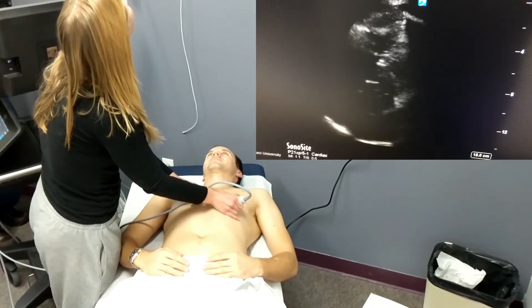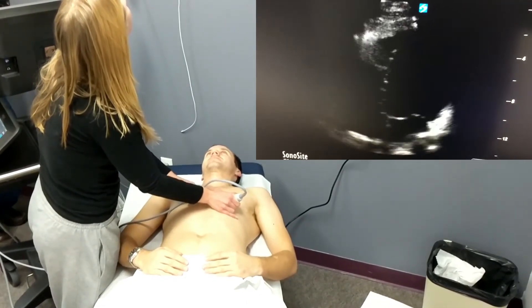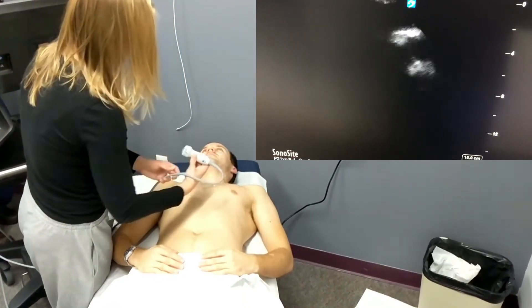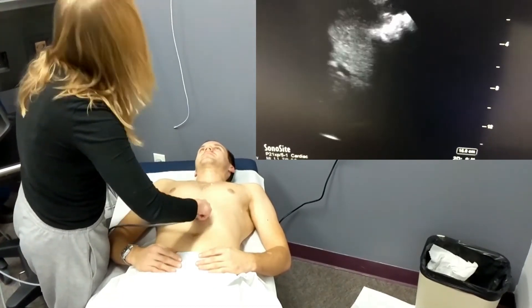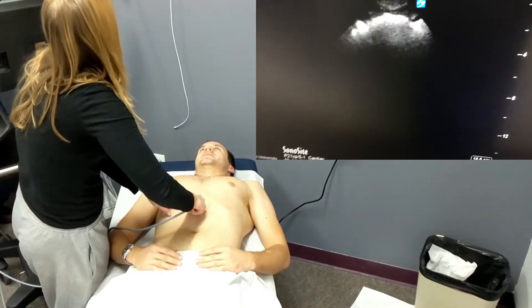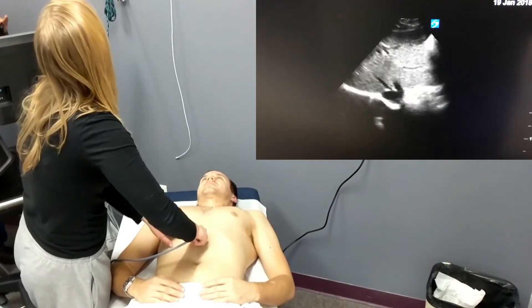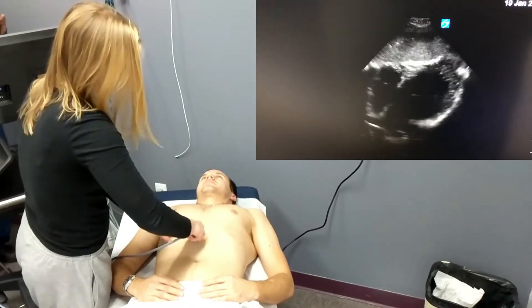She's also looking for any signs of pericardial effusion and any signs of right ventricular strain, ensuring that the right ventricle is the normal size — meaning it's about two-thirds the size of the left ventricle. Here she has moved from the apical four-chamber view to the subxiphoid view, placing the transducer almost parallel to the examining table in order to get a good view of the heart through the liver.